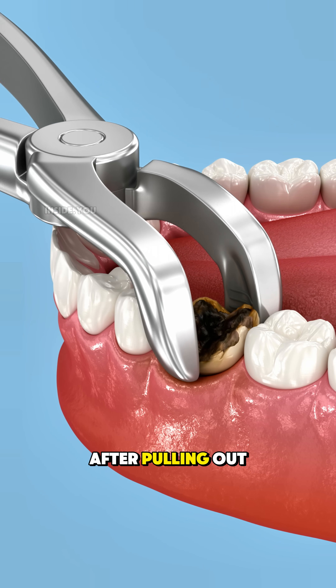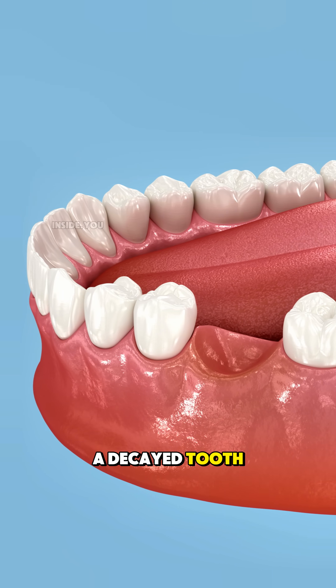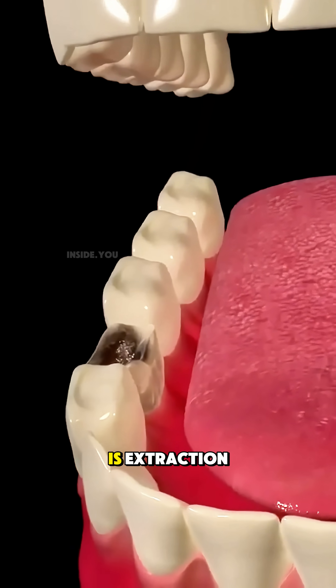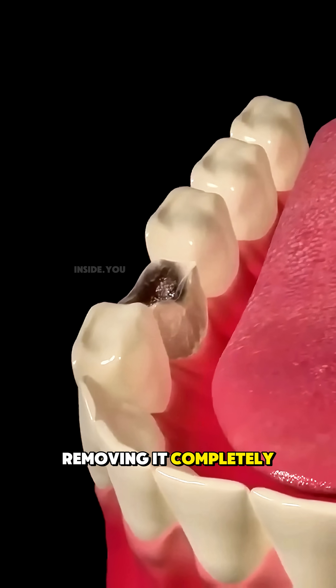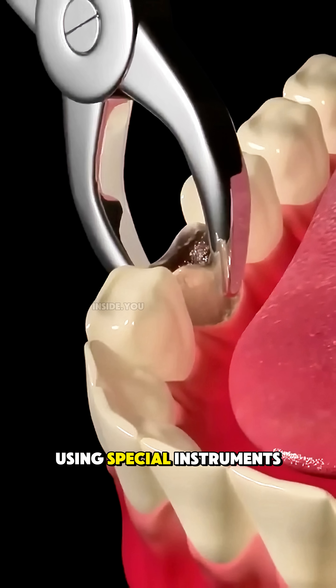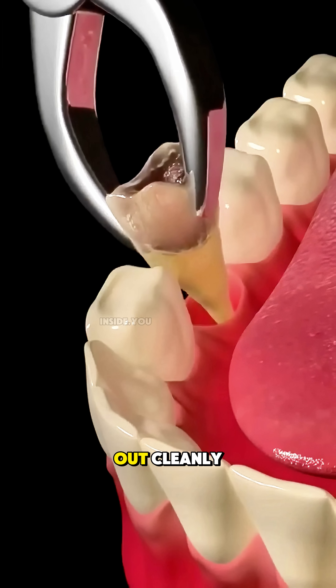This is what doctors really do after pulling out a decayed tooth. When a tooth becomes too damaged to save, the only option is extraction — removing it completely. The area is numbed, and the dentist gently loosens the tooth using special instruments until it slides out cleanly.